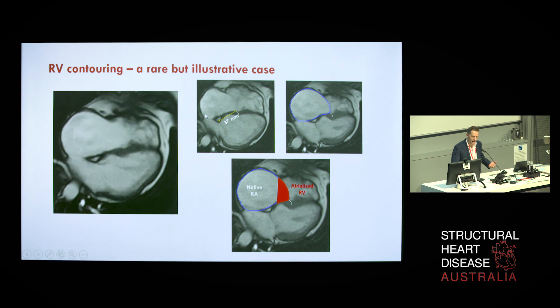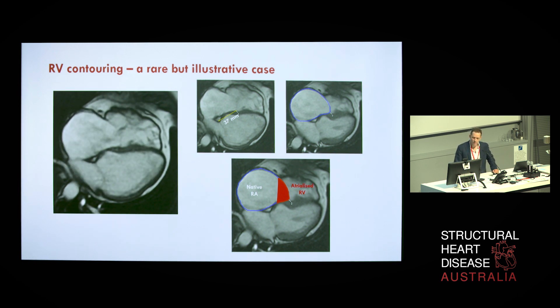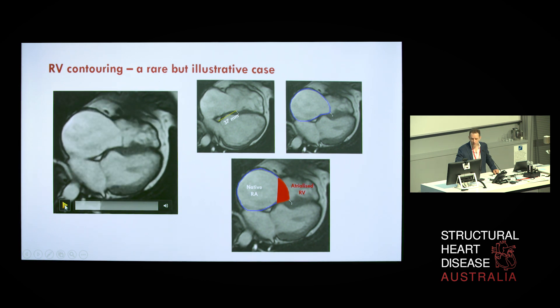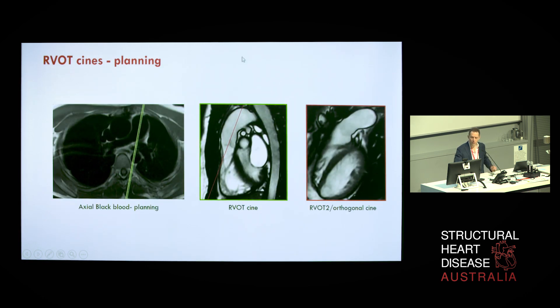A rare but illustrative case that sums up many of these messages: the tricuspid septal leaflet is significantly apically displaced up to 37 millimetres, making the functional right atrium very large while the right ventricle is relatively smaller, with an area of atrialized right ventricle — that of course is Ebstein's anomaly. One would need to be very careful when contouring the right ventricle in order to accurately identify where the tricuspid valve plane is and assess its various septal attachments.